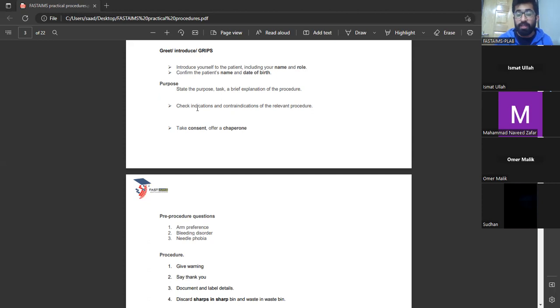Then, important thing, explain what you are going to do. You are going to pass a thin flexible tube called a catheter, and it should not be painful. It would reduce your abdominal pain and your distress. So can I proceed? That's how you take consent.